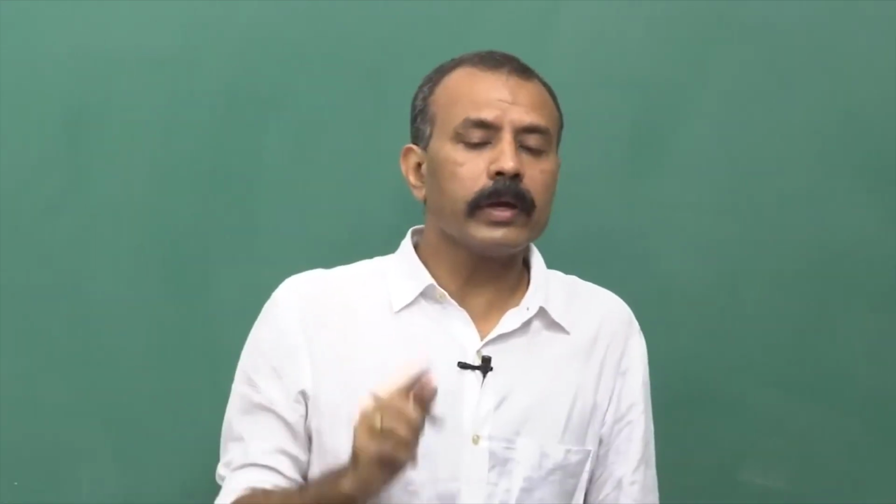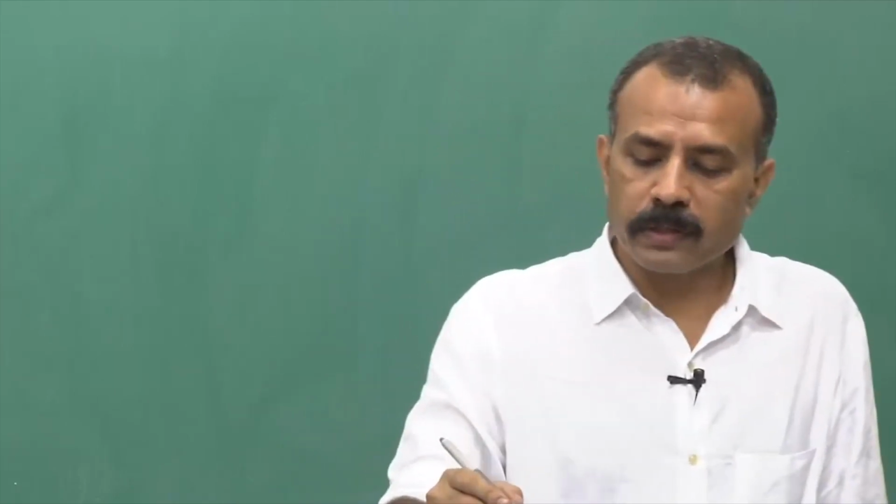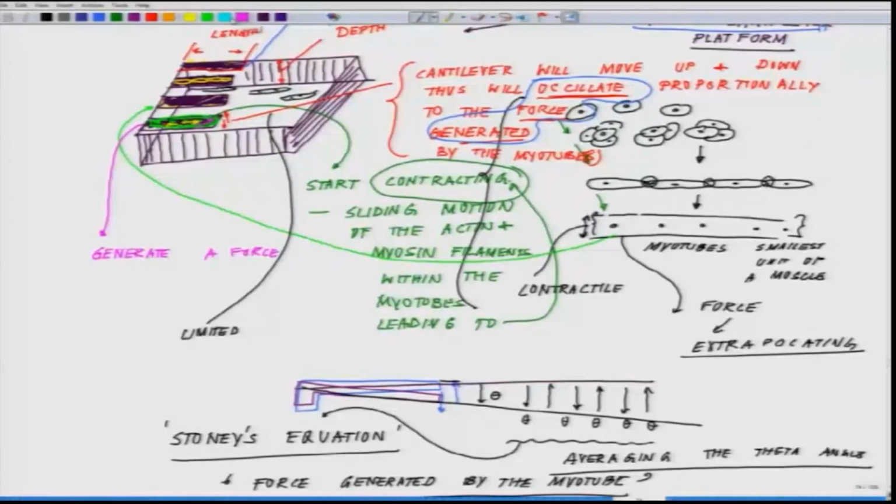The way you can avoid it is, say for example, you coat or spray this surface with something which will not allow the growth of the cells, some kind of surface coating. While the mask is already there, you first coat it in such a way that nothing ever grows on these walls and not on these surfaces.